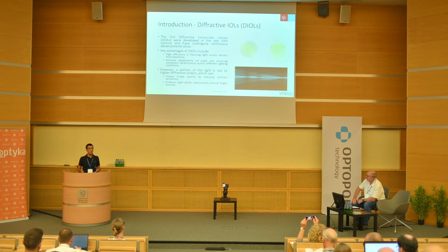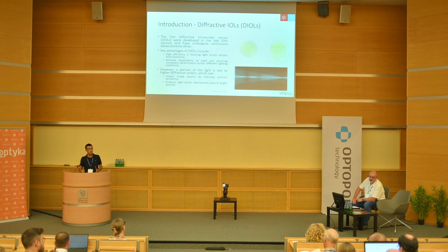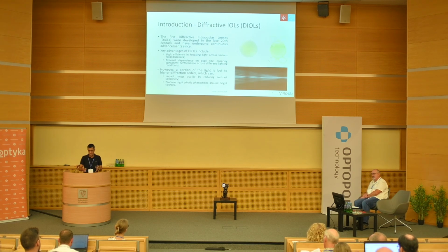Many of those are diffractive IOLs, and most of the lenses are made for a full vision range. This is a new name that came out now in the new ISO standards. Full visual range applies to lenses that have a large through focus that is more or less continuous. And the design I'm going to present today is included in that new category.